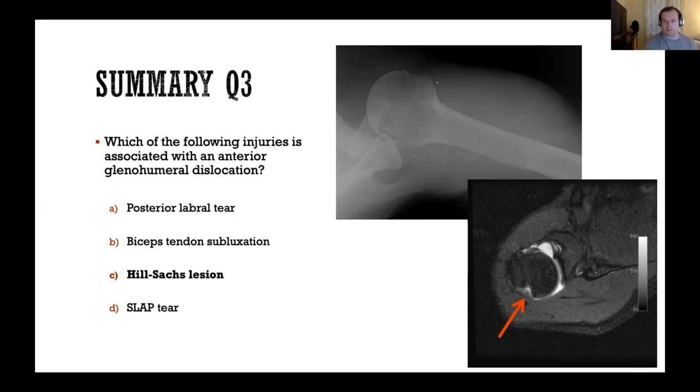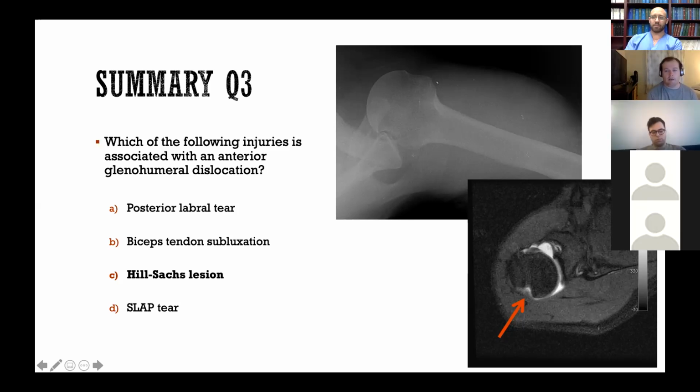Okay. Another question, how often do concerns about radiation exposure determine the imaging you get for evaluating patients? I think generally we will get the imaging that's required for the patient to have an accurate diagnosis. Really the only time that we'll consider radiation is if a patient is pregnant or we're concerned for pregnancy, particularly if we're talking about using a CT versus an MRI. In pediatric patients too, we'll try to limit our radiographs, but if you need to get a CT scan to assess something further, we don't hesitate.